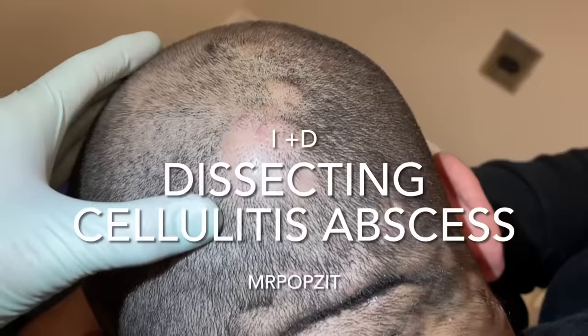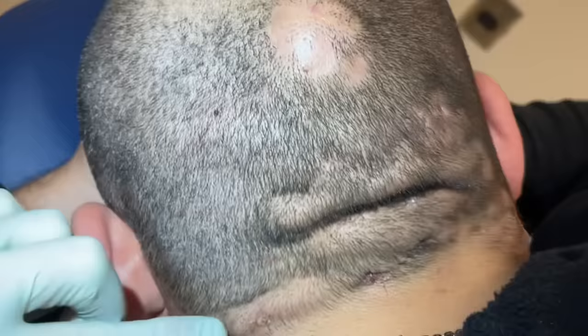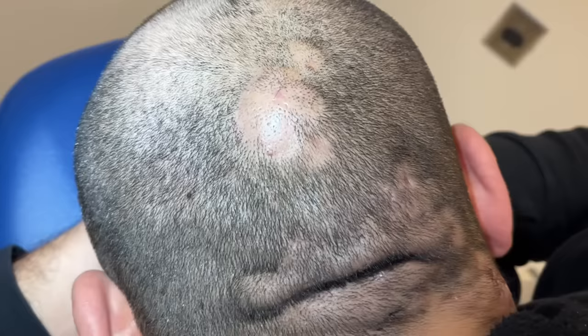Hey guys, Mr. Popzit here, Greg Lynch, Stern, PA. We have a very common condition — we've had multiple videos like this — and this is dissecting cellulitis of the scalp. You can see the pockets that form, and it actually separates the skin. You can see areas of drainage and scar tissue formation. This goes along with hidradenitis suppurativa.